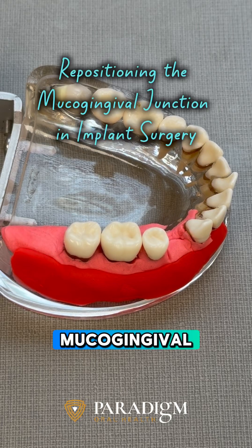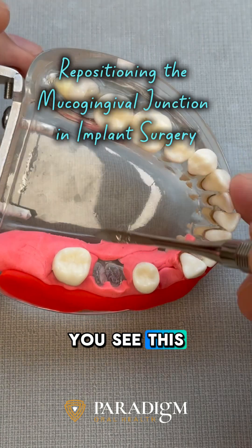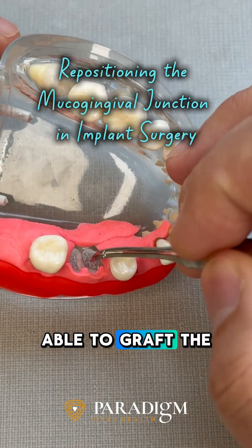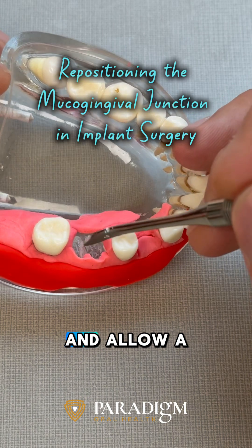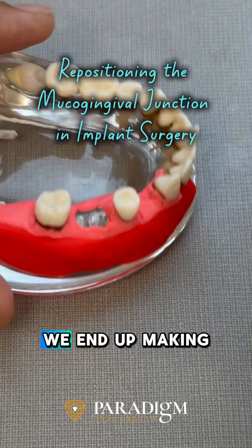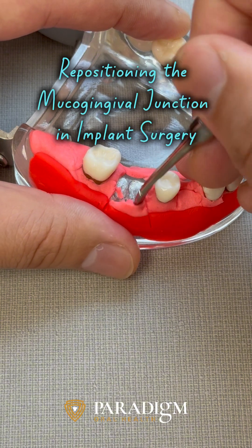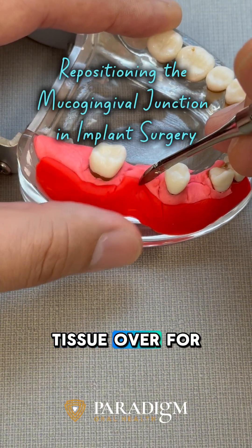Today we're going to talk about repositioning the mucogingival junction. When we extract this tooth out, you can see the attached gingiva area and unattached gingiva, and where we mark the mucogingival junction. Sometimes we are able to graft the site and place the membrane and allow attached gingiva to form. However, sometimes due to a large defect, we end up making an incision and pulling this tissue over for a primary closure.